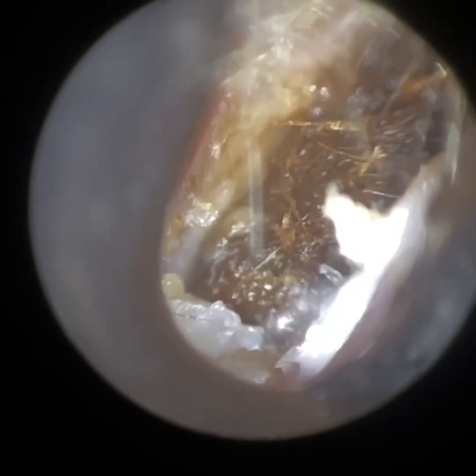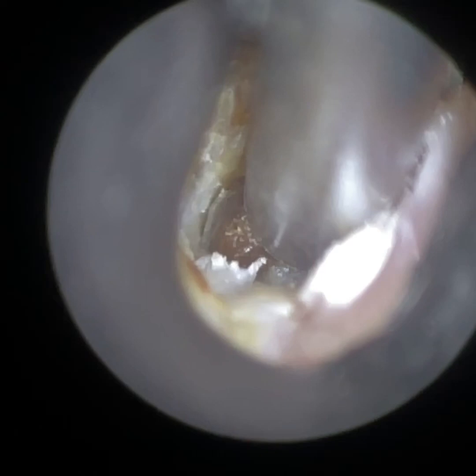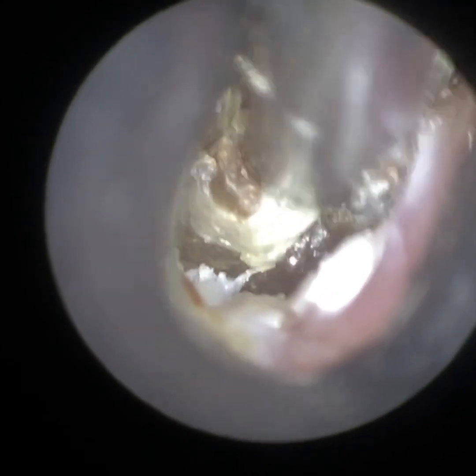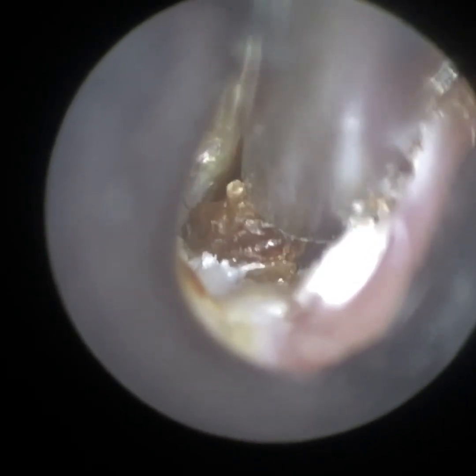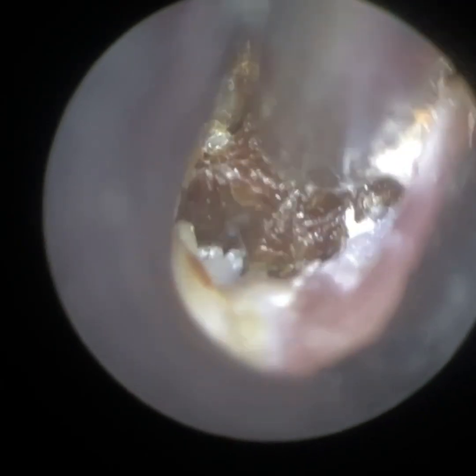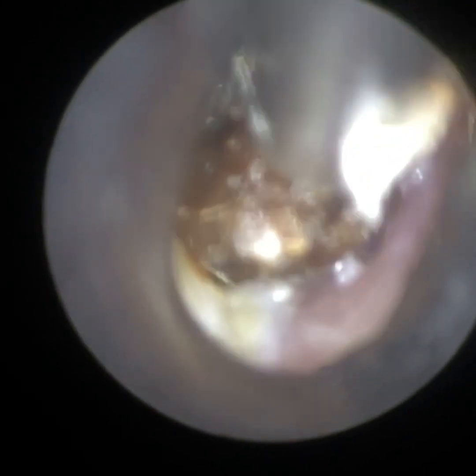You still can't quite visualise the eardrum — but just about at nine o'clock, we can just see a hint of it there. This patient did quite well getting the cotton bud into their ear, truth be told. I'm just lifting this up and out of the inferior recess because it's trapped inferiorly — we're about two and a half centimetres, give or take, into the ear canal with the sucker. I didn't want to use a fine end — a fine end would have been easier in the sense that it's narrower for the narrow ear canal, but it just wouldn't have the suction power. Even with the big sucker, it's really difficult to elevate this away. And slowly but surely, we're bringing this out.